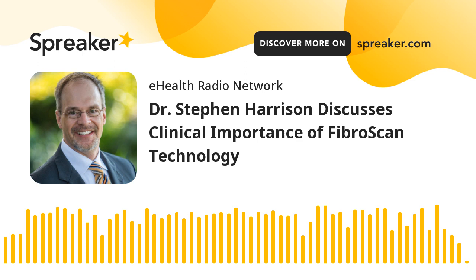Absolutely. So, again, I mentioned at the top that I do FibroScan on all of my patients that I see in clinic. In fact, I have clinic tomorrow again, and I give the patients a copy of their FibroScan when they come to see me. And let's say it's abnormal. Let's say, again, that CAP score is above 280. Let's just pick a number, 340. And the KPA is abnormal. I said less than 6 is normal. I worry when it's greater than 8.5. So let's pick a 12 KPA. So let's say our patient has a CAP of 340 and a KPA of 12.